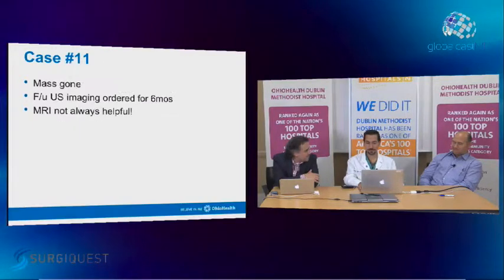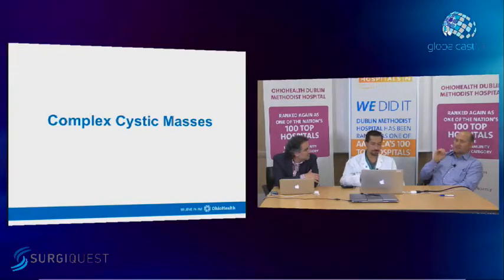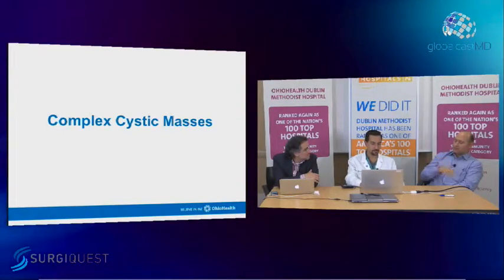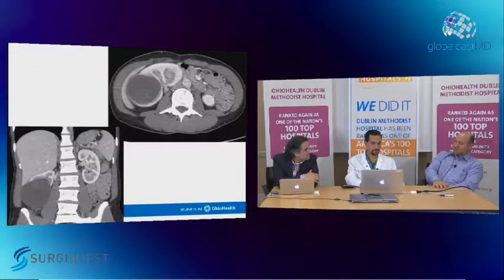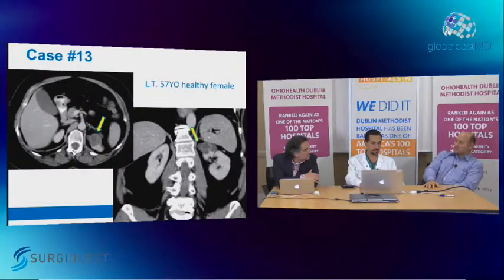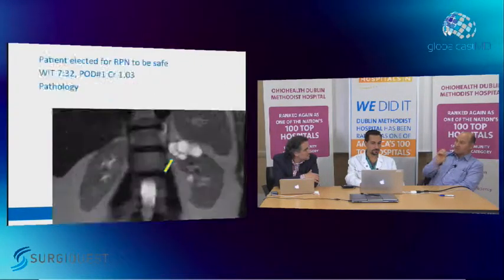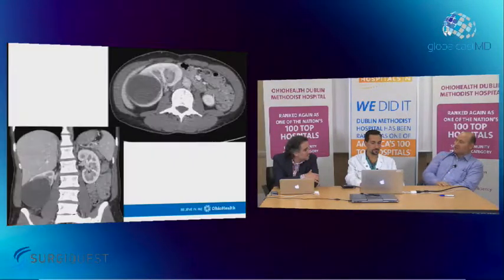I think kind of a corollary to that is that some of these small renal masses you do see in the kidney, they're endophytic. I will get an ultrasound on them pre-surgery just to make sure somebody can see them with ultrasound, because I've been unpleasantly surprised during surgery trying to find these masses with ultrasound and not being able to see them, because they look very isoechoic sometimes to the normal kidney parenchyma, and I think it's really good to get an ultrasound on those patients beforehand.